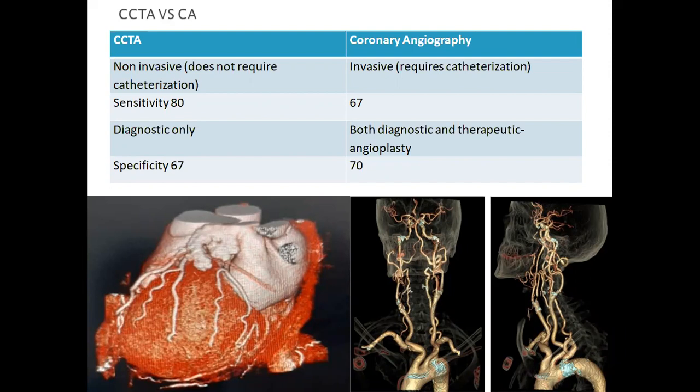While on the other hand, the CCTA may not show the coronary arteries all the way up to the apex, which is one big disadvantage of cardiac CT angiography. It may not show the small vessels, and even the vessels that it shows, it may not show them all the way up to where they end. So if there's any reduction in size, or any stenosis in the distal part of the coronary artery, this could be missed.